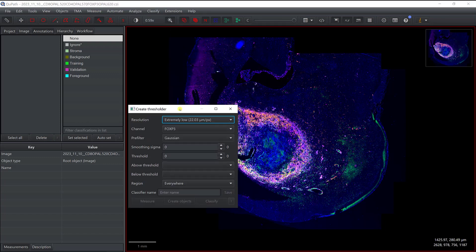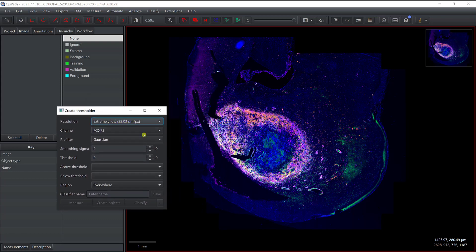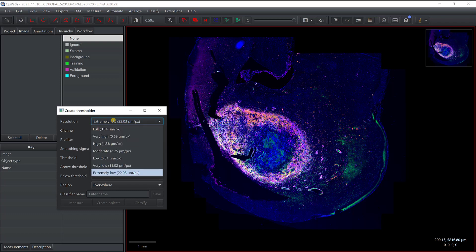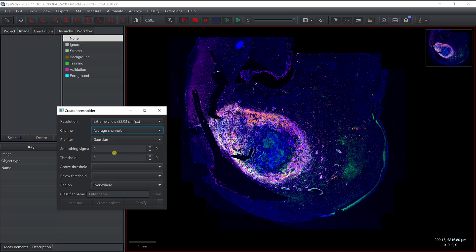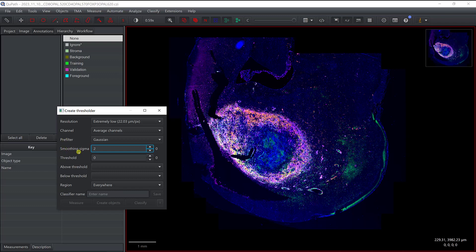Here you can use a different resolution. Since we want to identify the tissue, taking a very low resolution is probably the best option. You can average the channels, which is probably the best solution, or you can just look at the DAPI. We can also apply a Gaussian filter for smoothing.